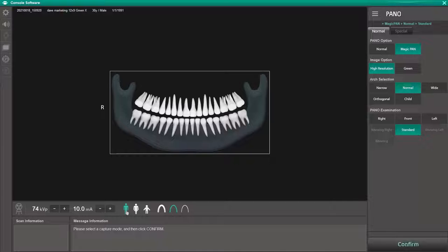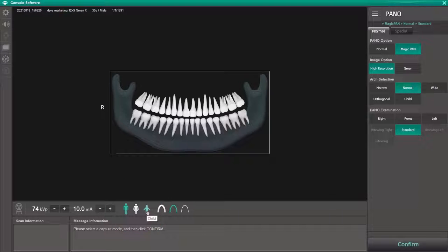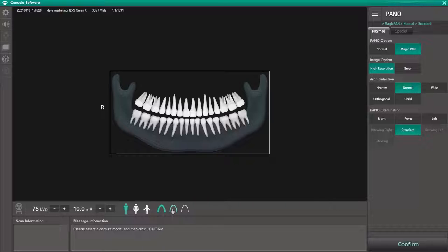First we start with patient gender: man, woman, or child. Note the system will automatically select child if the age of the patient is 12 or under. To the right of gender we have exposure-based settings based on the patient's density and size. Options are hard, standard, or soft.